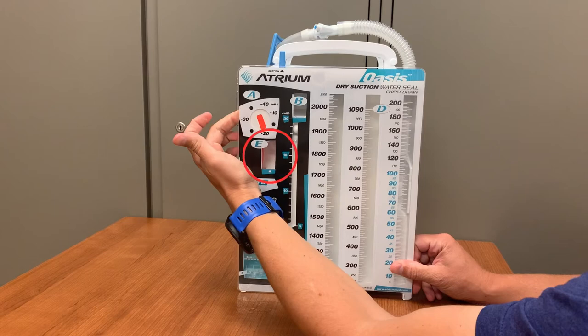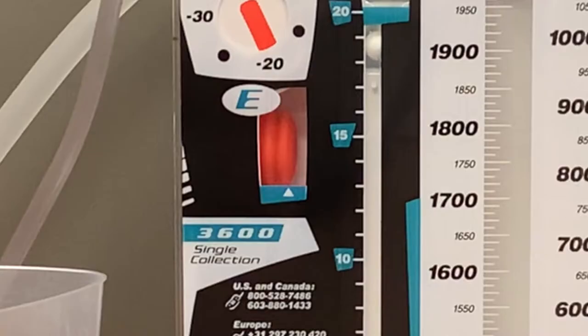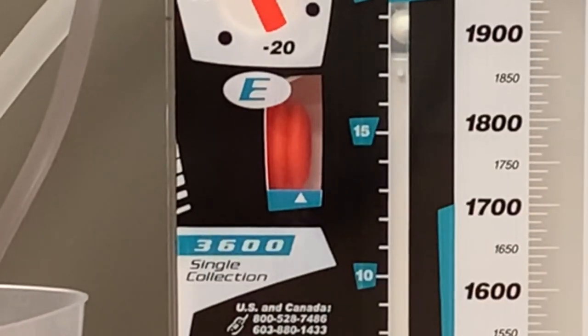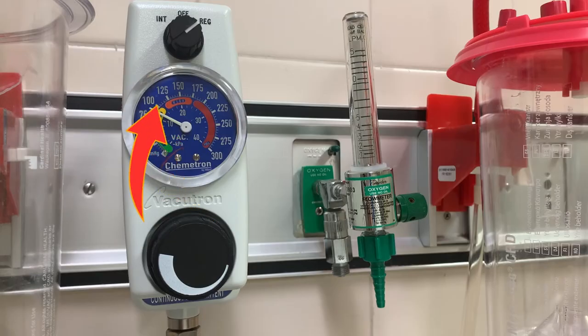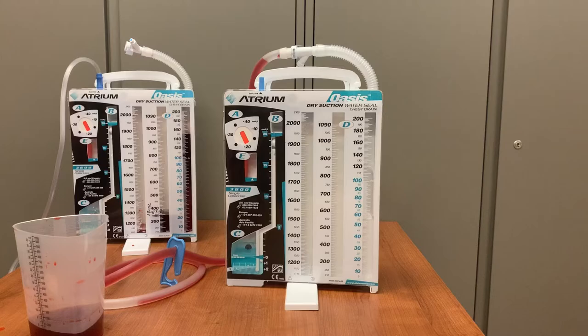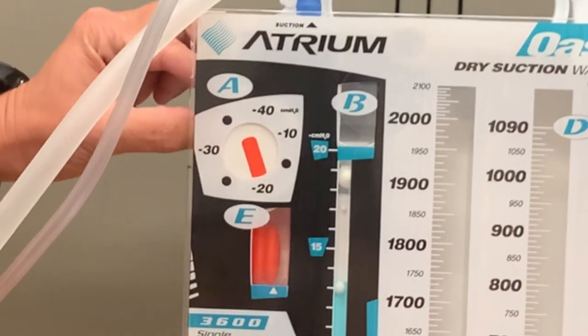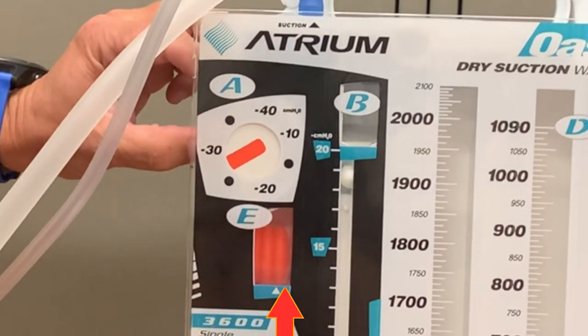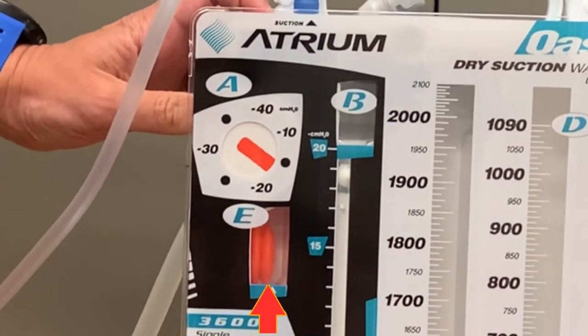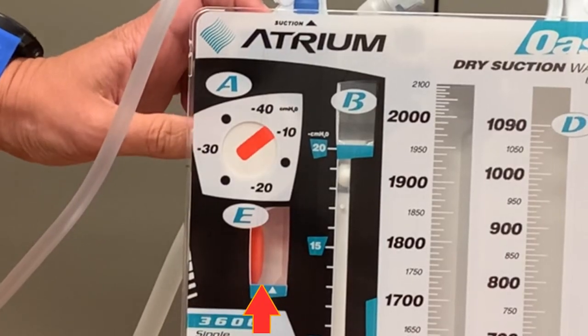The chamber directly below the suction dial, labeled E, contains a small orange bellows. When suction is turned on, these bellows should expand into the visible window. A triangle denotes the proper inflation when the suction is set to negative 20. If you are set to negative 20 and the orange bellows does not reach or exceed this marking, there is not enough suction being delivered to the patient. You will either need to increase the suction coming from the wall control if it is set too low, or it could mean the Oasis is not functioning properly and you will need to replace the unit. If the Oasis is set to negative 30 or negative 40, the bellows should expand beyond the triangle. If it is set to negative 10, the bellows should not reach the triangle marking, but should still be visible in the window.